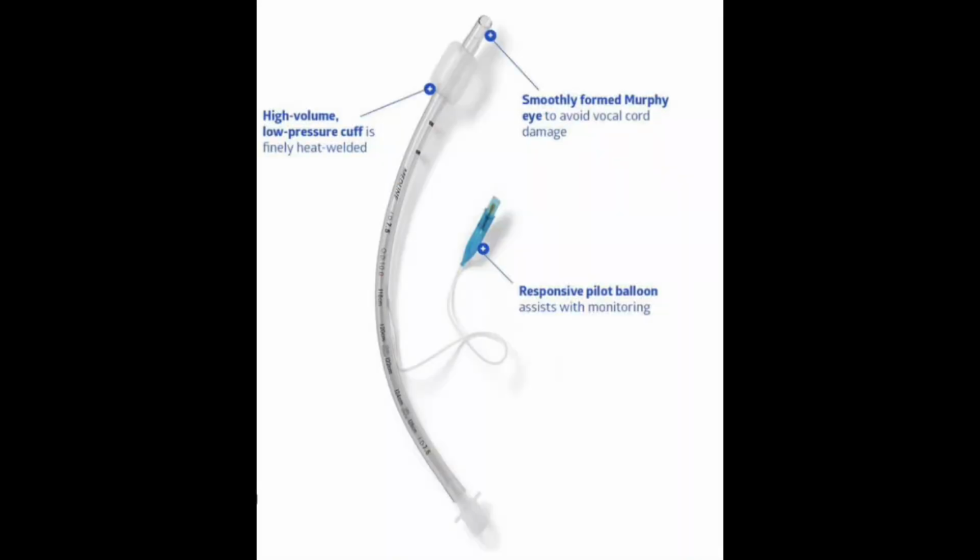There are three main parts of the endotracheal tube. The first one is the adapter. It connects the endotracheal tube to respiratory devices. The second one is the pilot balloon. We will insert air through it. And the third one is the high volume low pressure cuff. When this cuff is filled with air, it will get fixed into the trachea and it also prevents aspiration.